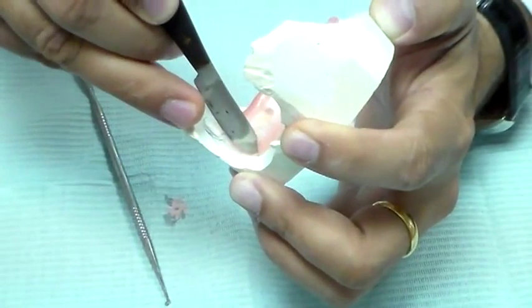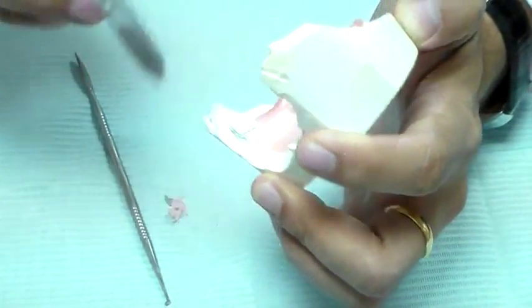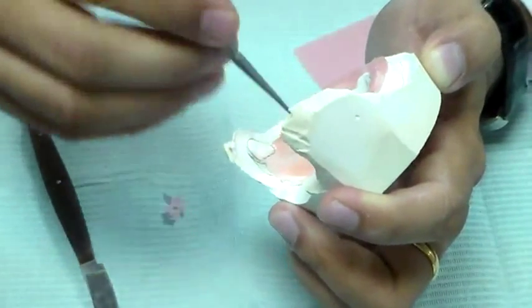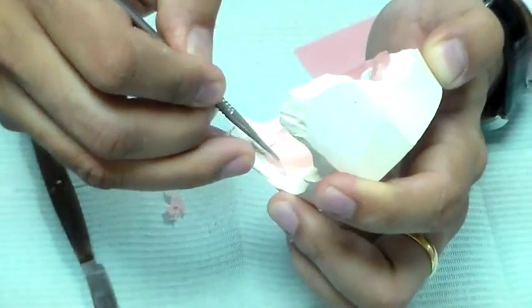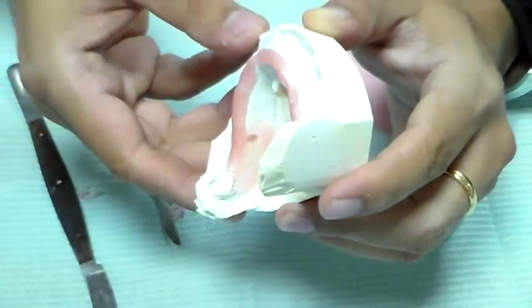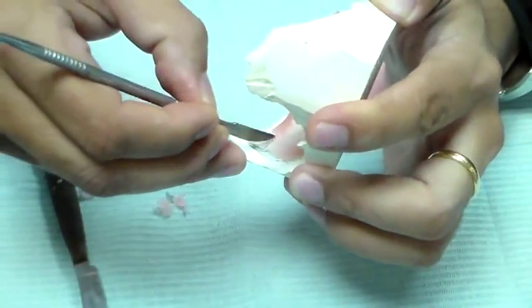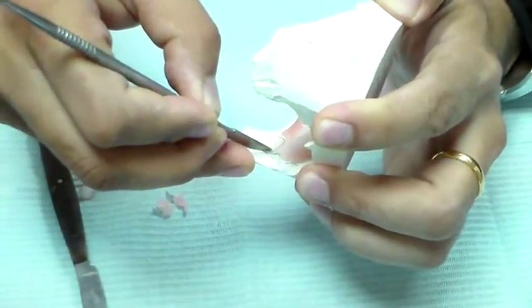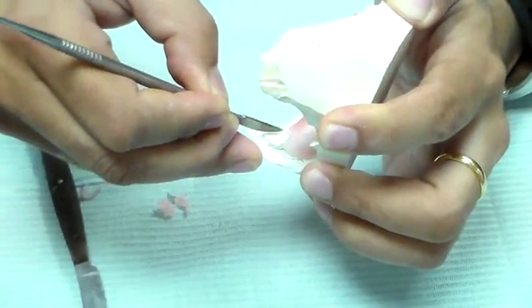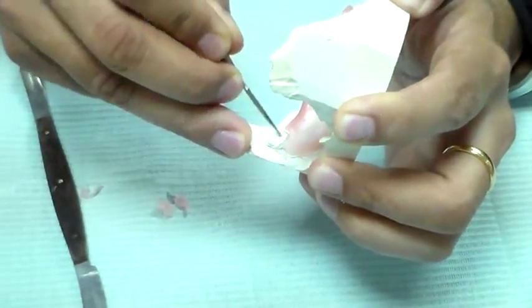I want to take off my wax near the tray border because I don't want wax on the tray border. That wax does not stick to the acrylic resin because it is not self-cure. With self-cure acrylic resins, they generate exothermic heat as part of the reaction, so you get the wax sticking on — but in this case, no. I also want to clear off my retromolar pad area; I don't want to relieve it, I just want to take off the wax from there.